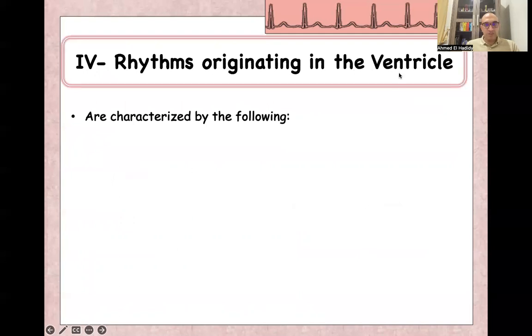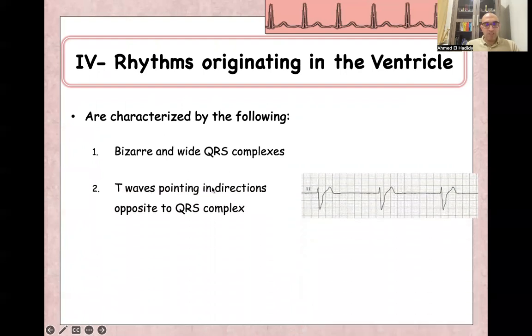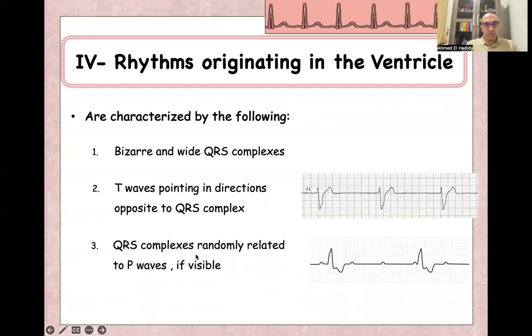The fourth classification is rhythms originating from the ventricle itself, characterized by bizarre or wide QRS complexes and a T-wave pointing in the direction opposite to the QRS complex — this is called discordance. So when the QRS is mainly negative, the T-wave will be positive, and when the QRS is positive, the T-wave will be negative. QRS complexes are randomly related to P-waves if visible — for example, in ventricular escape rhythm associated with complete heart block, the P-wave has no relation at all to the QRS complexes.